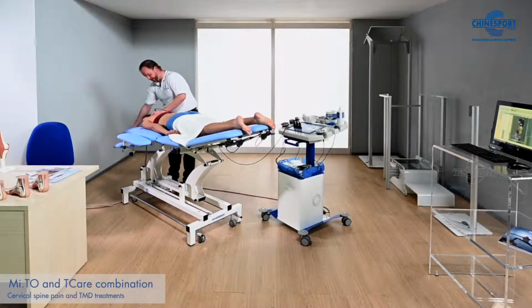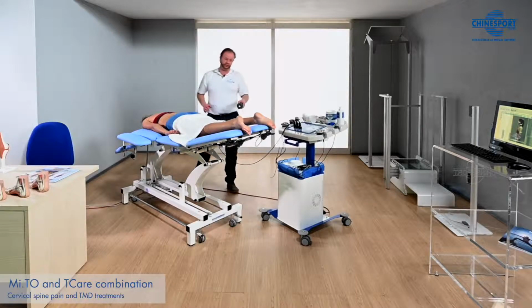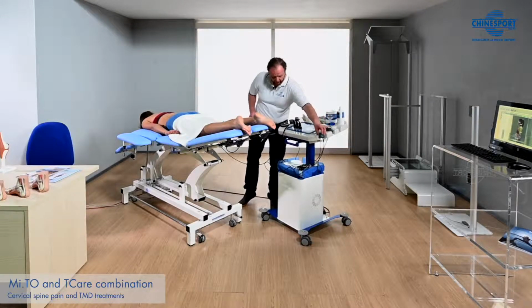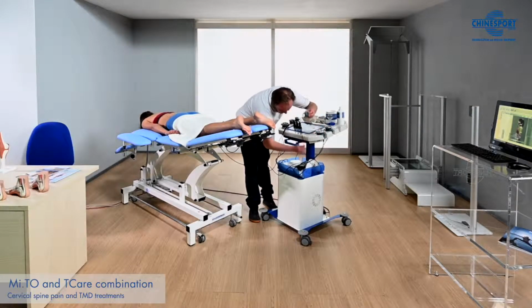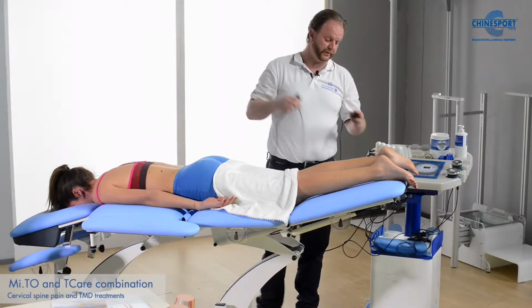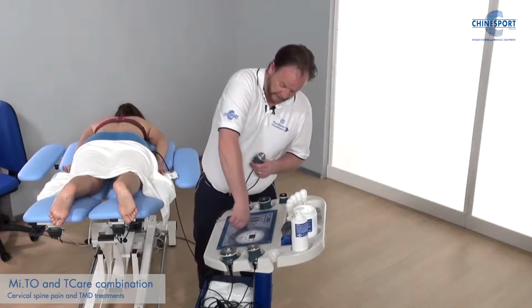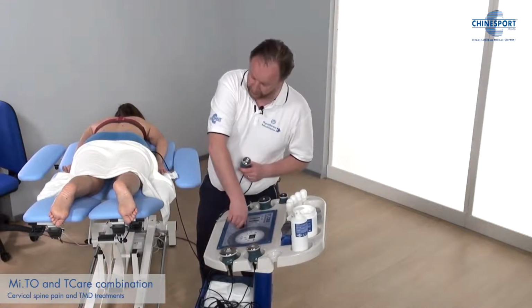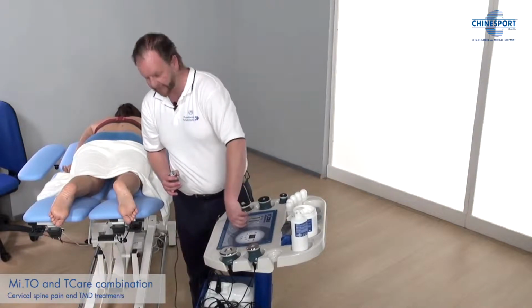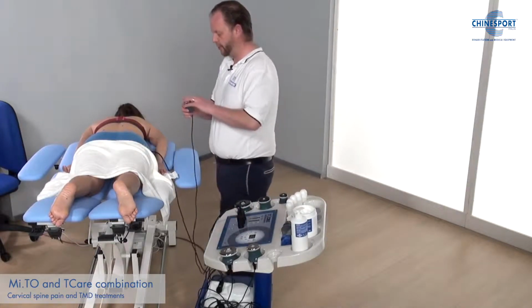I even find that this treatment works very well for patients with temporomandibular joint disorders. Temporomandibular joint disorders frequently have an element of problems in the cervical spine, and therefore I usually also combine therapy for the neck in temporomandibular work. And for the temporomandibular work, we use the smaller handpiece.